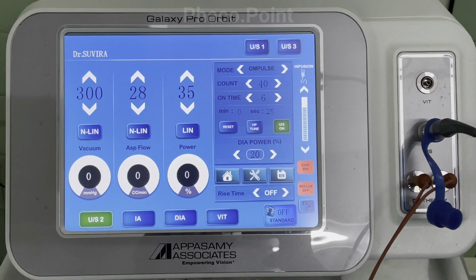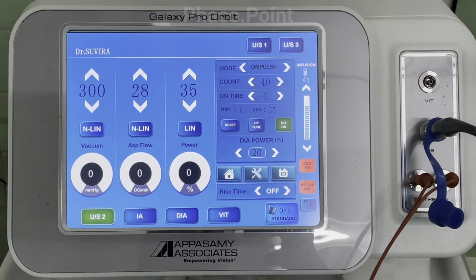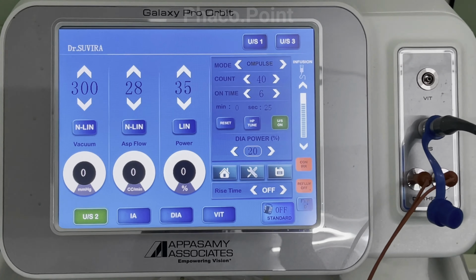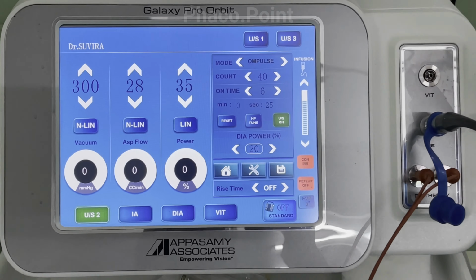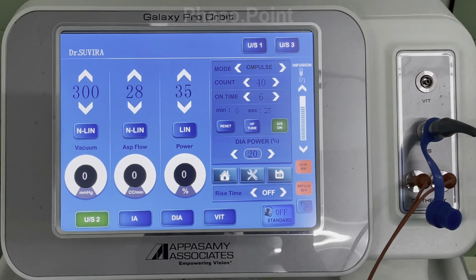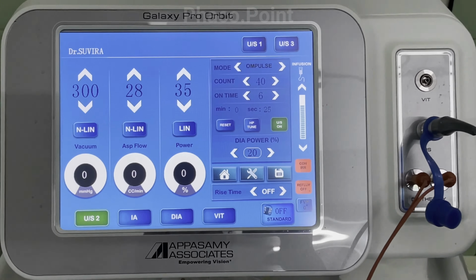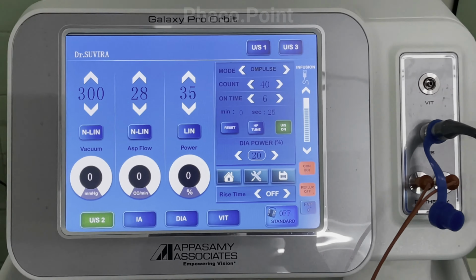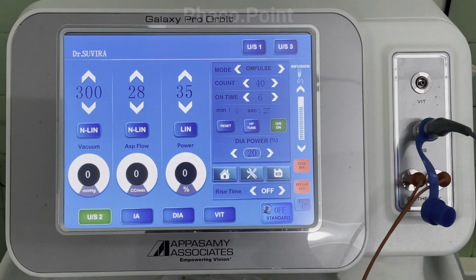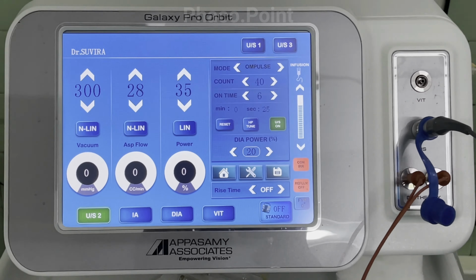The power setting that we have kept for our particular grade of cataract is 35%, which seems to be optimal. But please note that the phaco power here is delivered in a linear fashion, which means at the beginning of foot pedal position 3 it will start at 0, and as we progressively press the foot pedal, it will move to 35 at the point of maximum foot pedal depression.